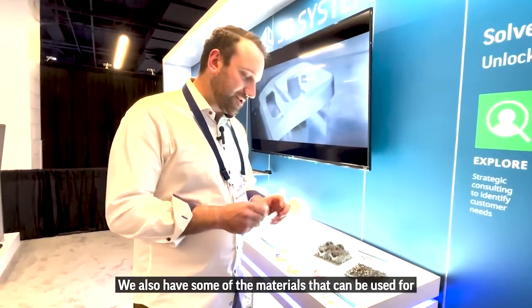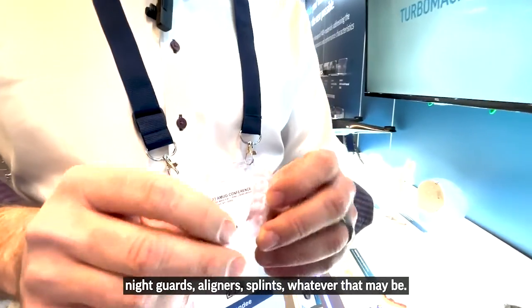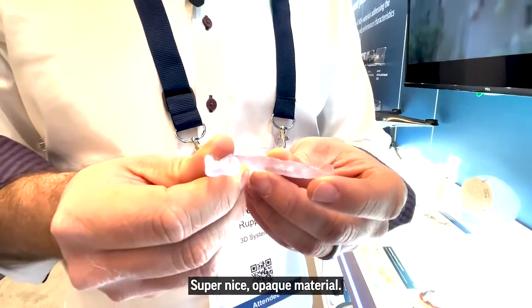We also have some of the materials that can be used for night guards, aligners, splints, whatever that may be. Super nice opaque material.